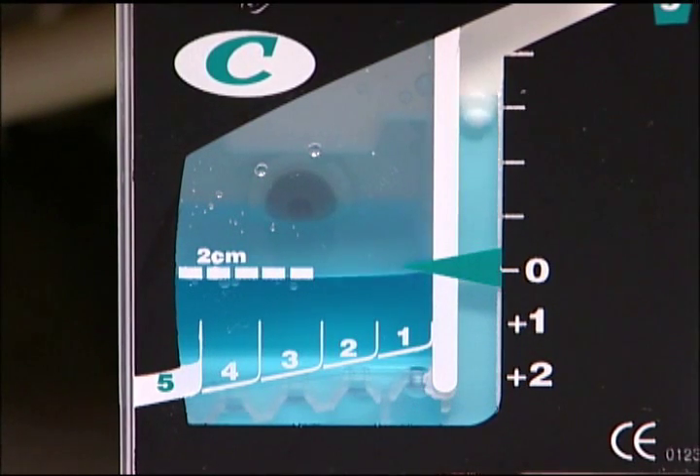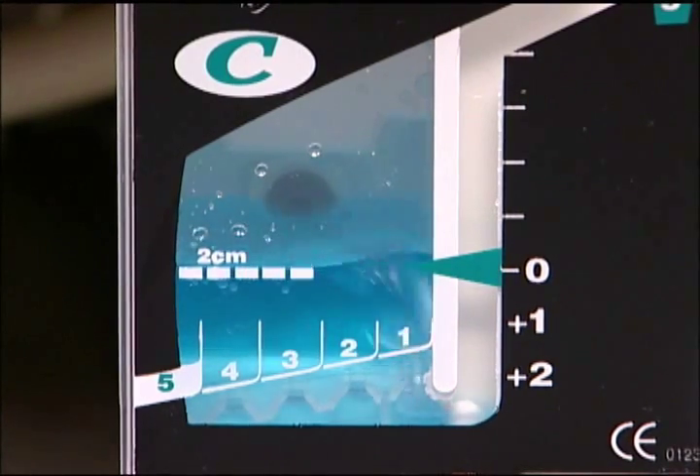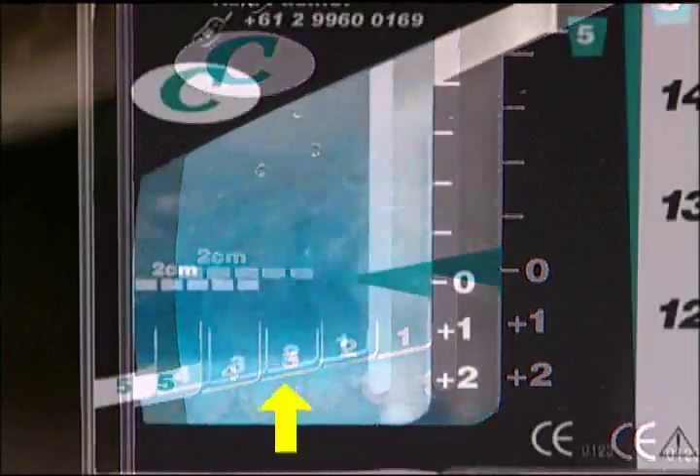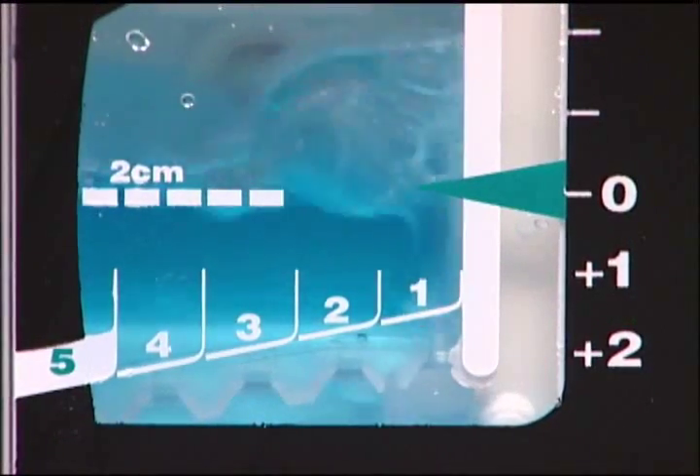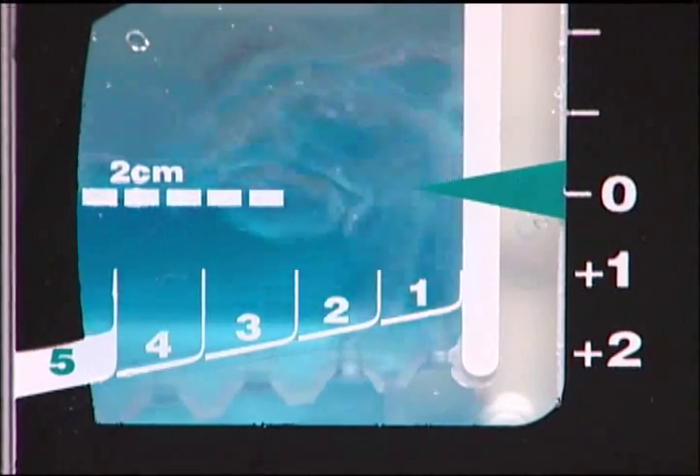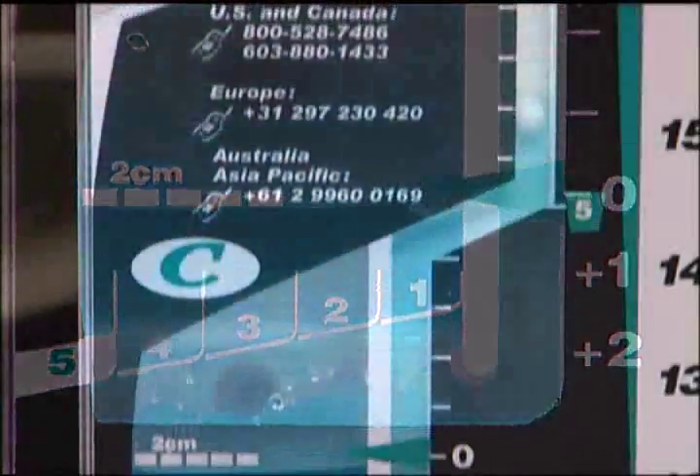The OASIS graduated air leak monitor allows visual detection of air leaks from a low volume of 1 to a larger air leak volume of 5. Air bubbles passing through the graduated air leak monitor help the clinician assess air leak patterns and patient air leak trends.